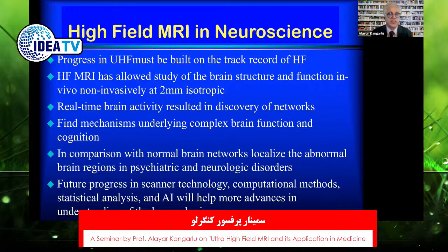And for instance, in the case of the most famous and most widely used contrast agent, gadolinium DTPA, it has done a remarkable job of, for instance, demarcating the boundaries of a brain tumor or different pathologies, or demyelination patches, lesions of multiple sclerosis. So the answer is we have multiple weapons in our arsenal to deal with the washout rate and fine-tune our pulse sequences, our hardware, and the chemical properties of the agents in order to give them a longer biological half-life.